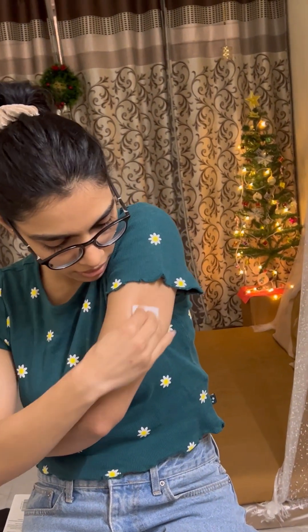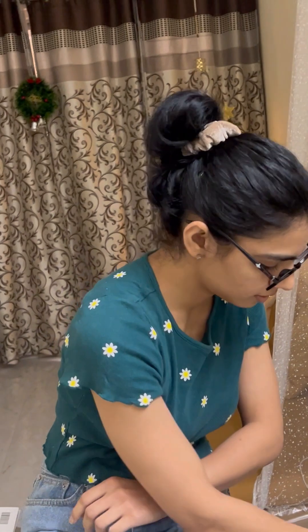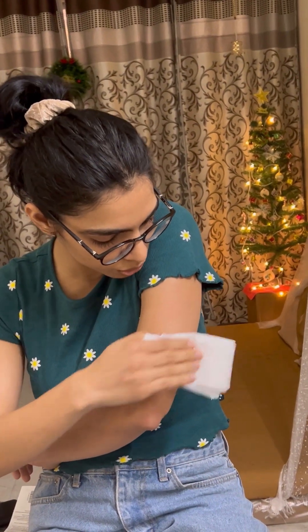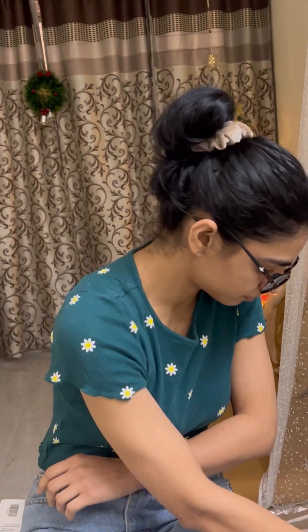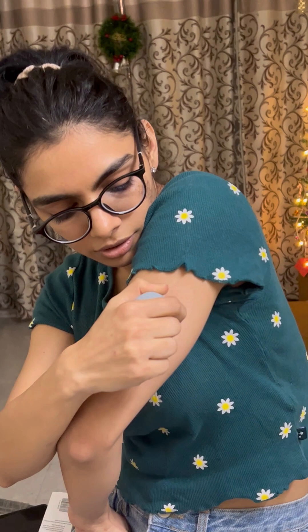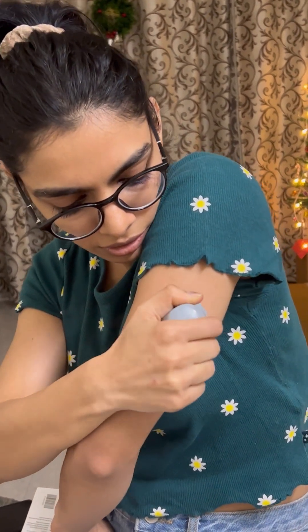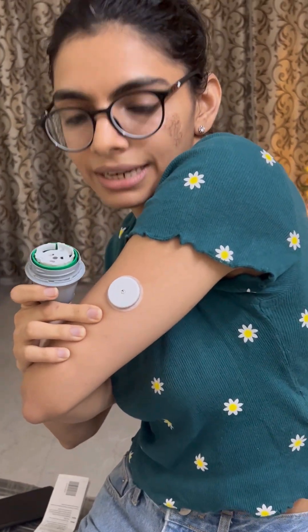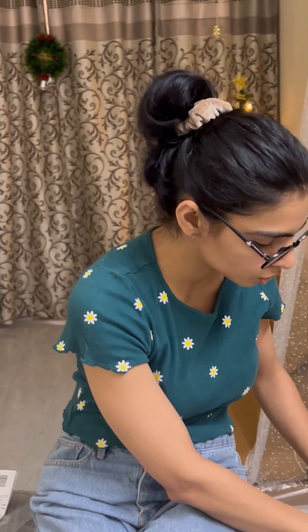I'll clean it and quickly dry it out with a tissue. As you can see, the sensor is in place right now.